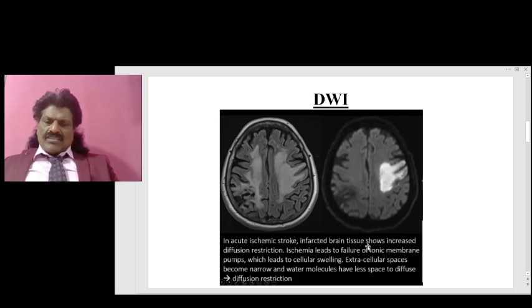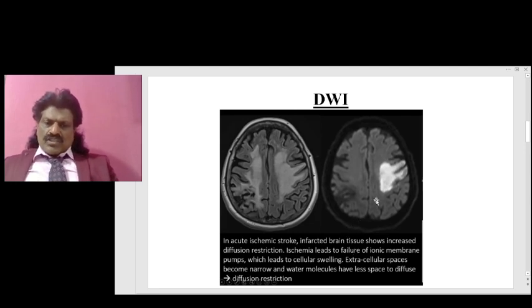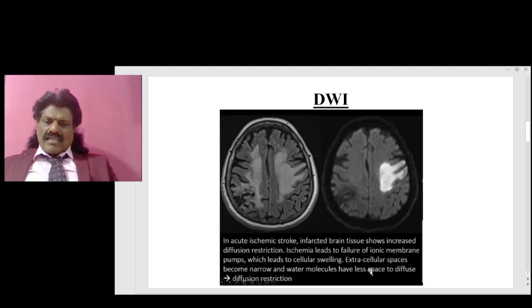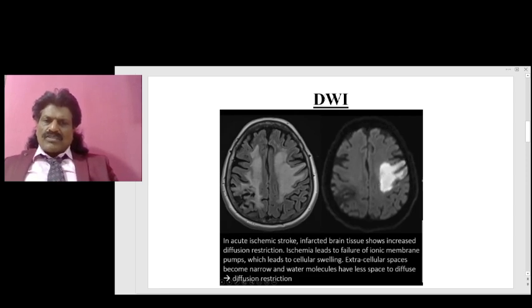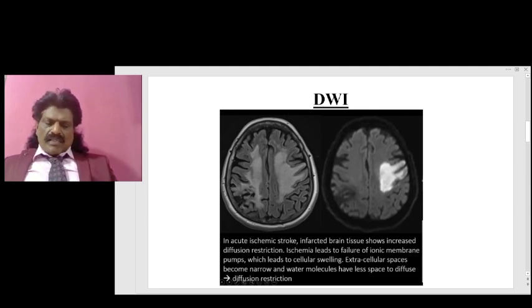Ischemia leads to failure of ionic membrane pumps — that is the sodium-potassium ATPase pump — which leads to cellular swelling. Extracellular spaces become narrow and water molecules have less space to diffuse. This is known as diffusion restriction, and here you can see the hyperintense signal on DWI — a very important and popular sequence.